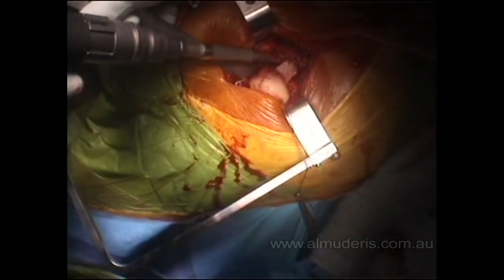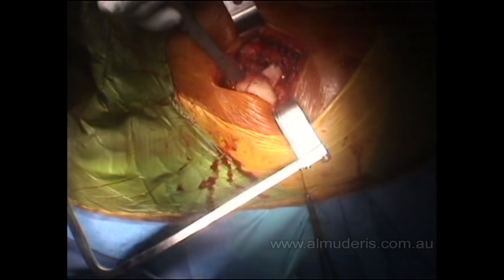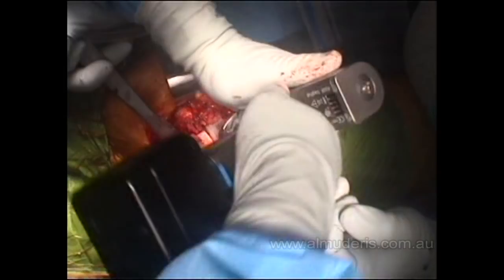That will ensure the canal is broached in the center. Going up by size with the reamers — I am reaming size two. It is worthwhile cleaning the reamer and removing any bone attached to it. After reaming, you can check where the lesser trochanter is. This is the psoas tendon and the lesser trochanter is just here — that is our landmark for how much neck cut is necessary.